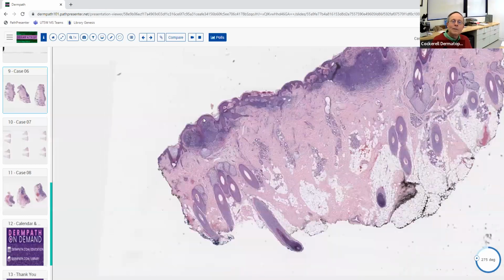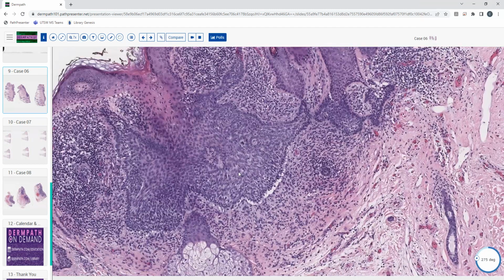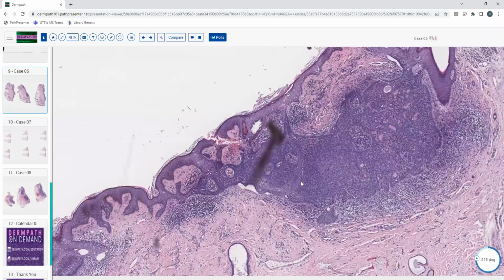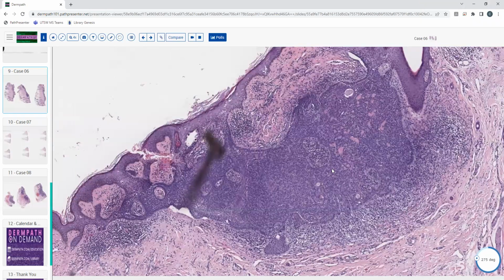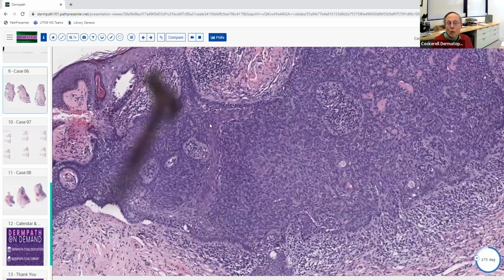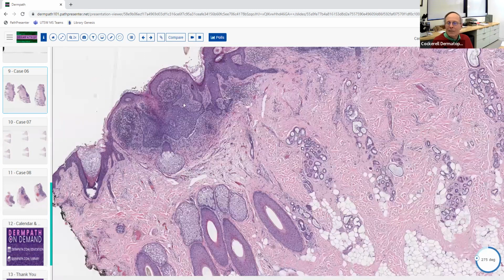Yeah, good. But there's a secondary tumor in there, maybe. What do you call this secondary neoplastic process here? Is that basal? There's clefting around it. It looks like basal cell to me, but it's not a real classic basal cell, right? It could be trichoblastoma too. Yeah, exactly. In the old days, these used to get called basal cell carcinoma associated with nevus sebaceous. They're almost never really basal cells. They're really these little trichoblastoma-like structures, these basaloid follicular proliferations that are associated with nevus sebaceous. They're not truly basal cells. They really rarely behave like basal cells.